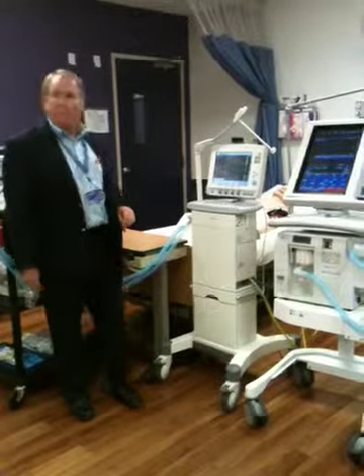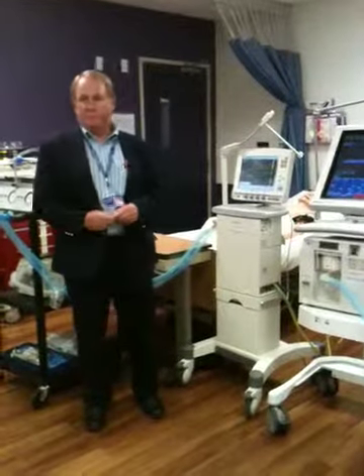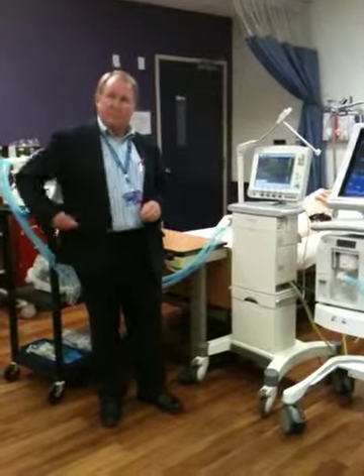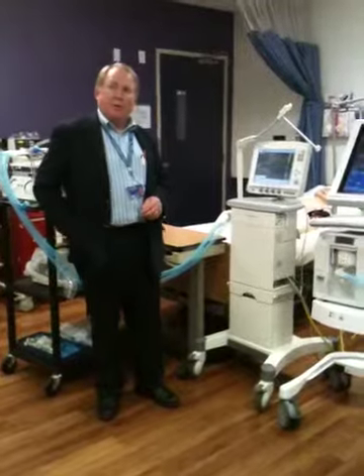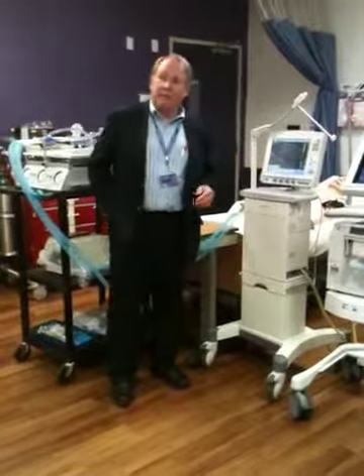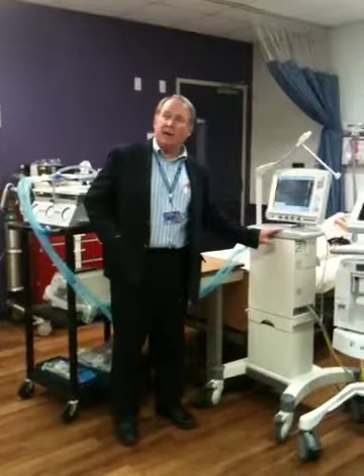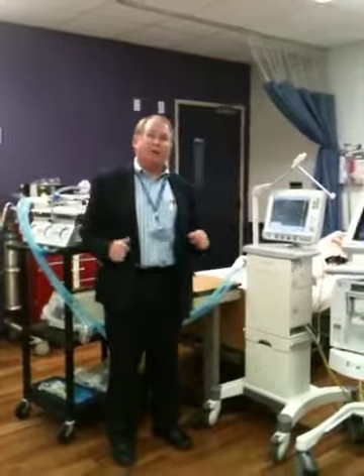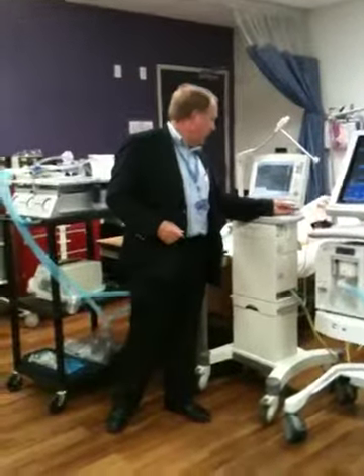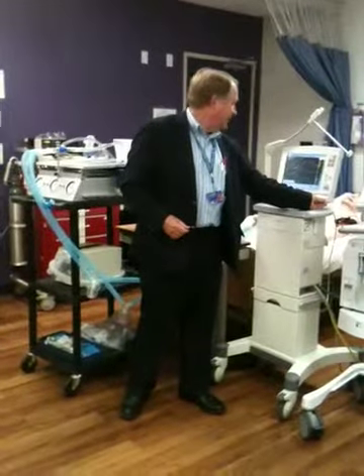I got a question. Say if we want to find out their static compliance, do the monitors do that math for us, or do we normally do it like when we're in the field? Many times you're doing it in the field. Like in this case, as I said, it will not give me a compliance right now because it says I only calculate when you do a true breath hold, not a brief second.